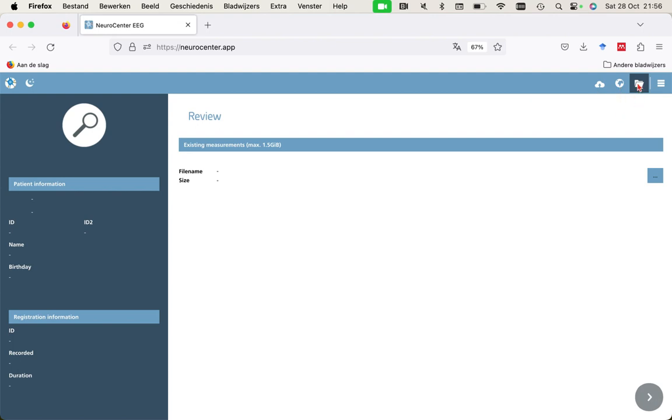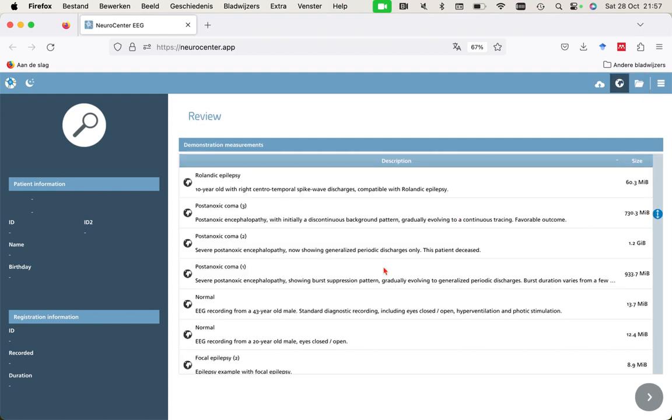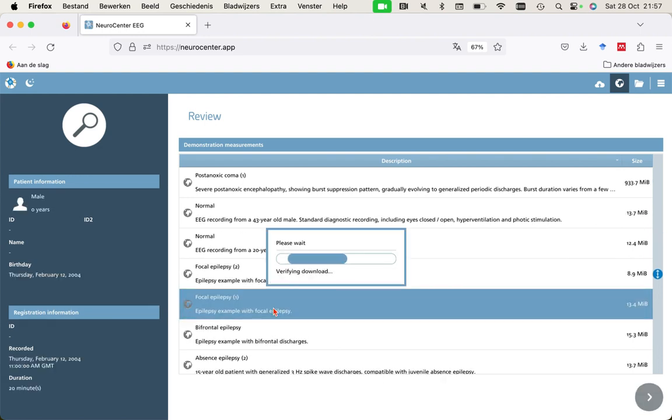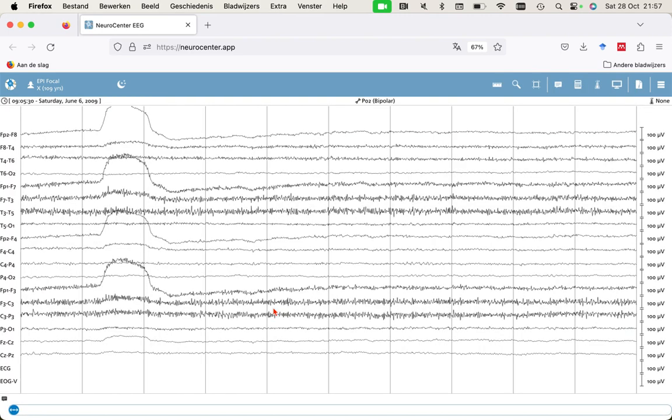If you click here and here, you can select your own EEG from your own local storage. But now we'll take one from the cloud. Let's take the focal epilepsy example. This is a nice example. Here we have the EEG. You can officially review.